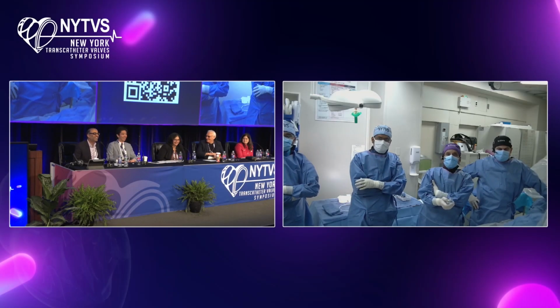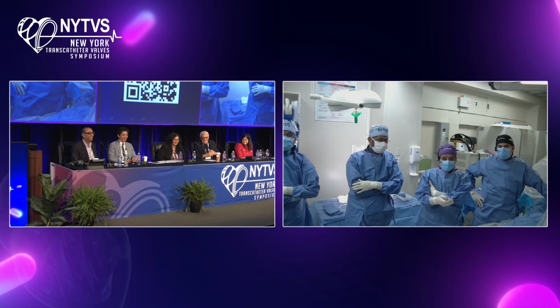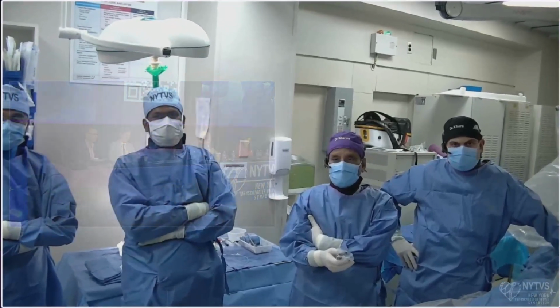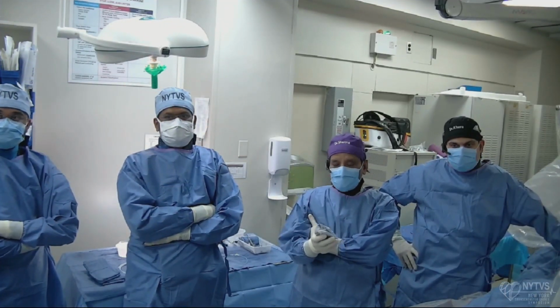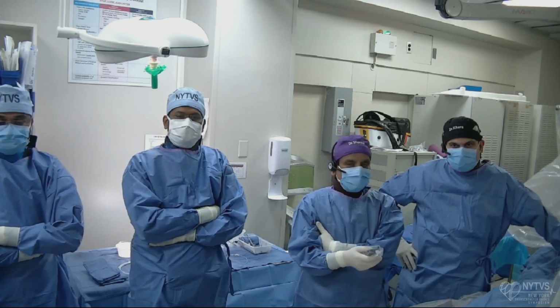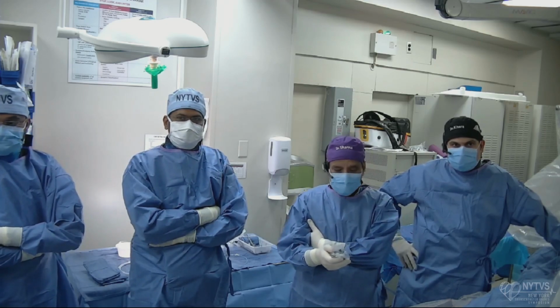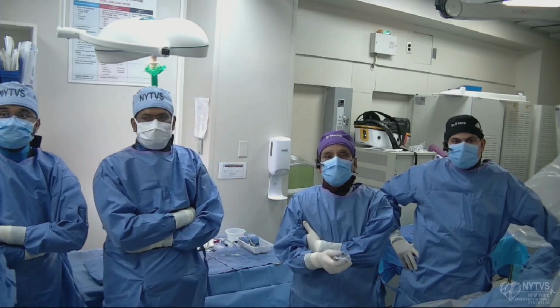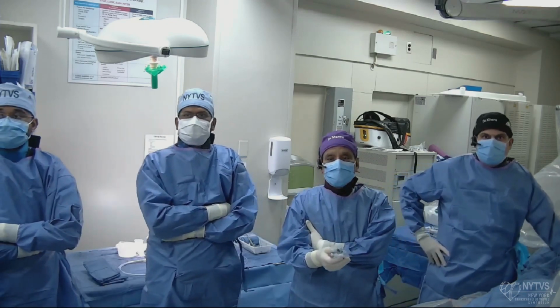Right, Tarun? Very good. As I said, with the simultaneous case, we are going to show sequential, actually, not simultaneous. The only change is our fellow here, Penta, as I mentioned, we have 3 structural fellows. Let's start, show the slideshow, case number 4. Show the slides, please.